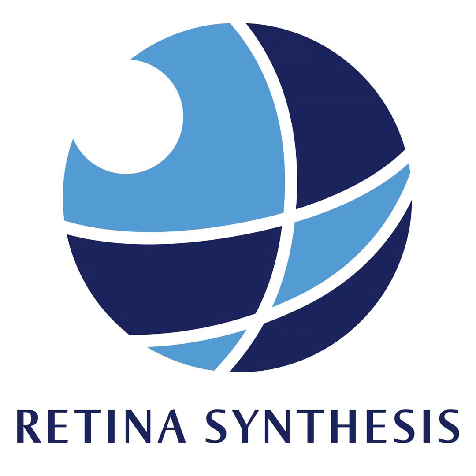But most of the time, when people generate B scans, they're generating 47, 50 B scans over a region, at most 97 B scans. But with swept source OCT, we can generate 500 B scans in a 6x6 region like that. And we get a representation that allows us to see all the individual foci forming. And macular degeneration just doesn't progress along the horizontal dimension, and that's all the B scan gives you. It gives you a horizontal dimension. Age-related macular degeneration is a three-dimensional disease, and it can progress in a diagonal dimension or a vertical dimension. So you need dense B scans and an en face projection so you can see all the different foci of these hypertransmission defects being formed.